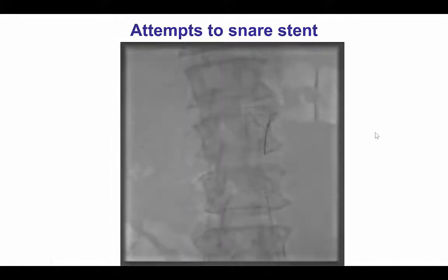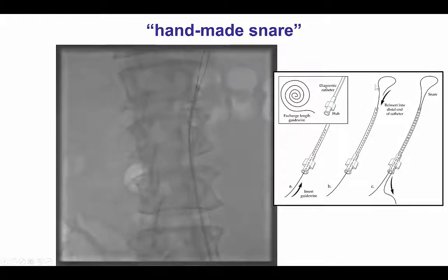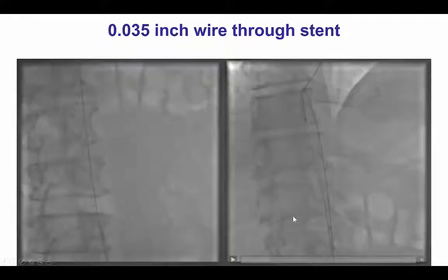We made attempts to snare the stent with a three-loop snare that were unsuccessful. We then made our own snare by advancing a long guidewire through a diagnostic multipurpose catheter. The front end was reinserted into the tip of the diagnostic catheter and pushed all the way back, and then by pulling the back end of the wire, we were able to make the loop of the snare smaller and capture the stent.